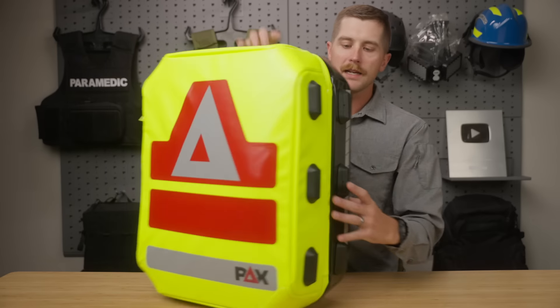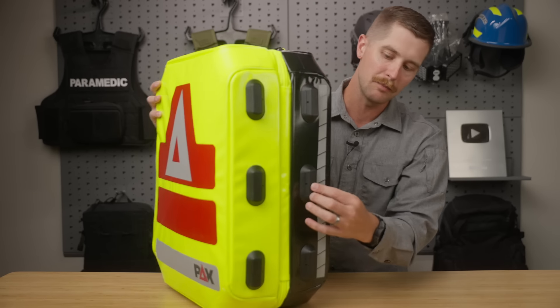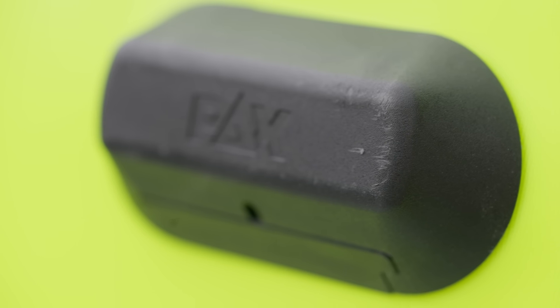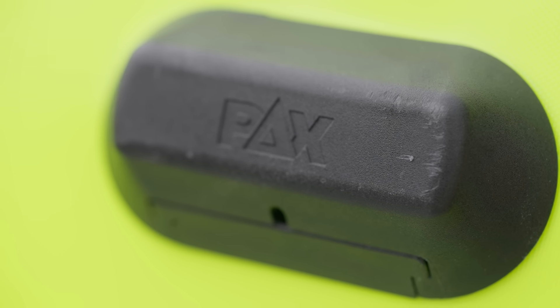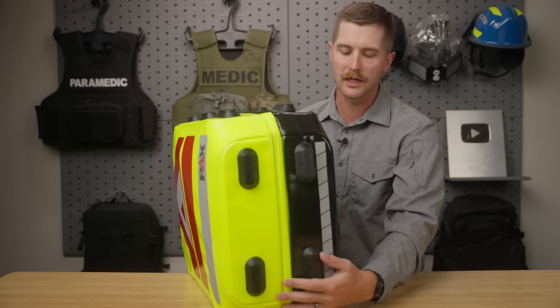On the side here you can see we've got these heavy duty feet. All of these can be changed out pretty easily — there's a little tab, you just pull that out, pull the feet off, put the replacement in. And then of course the bottom is no different; you've got four of them down here.